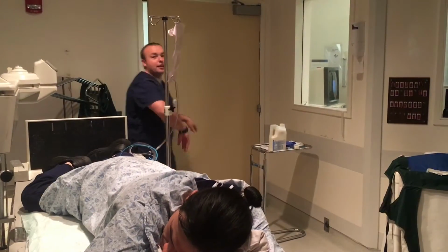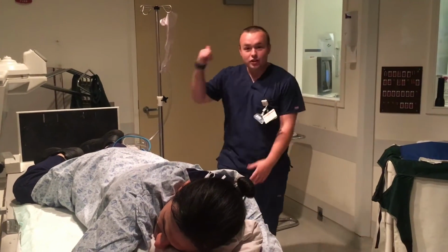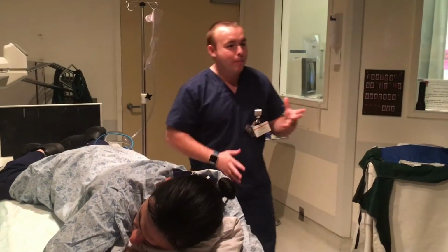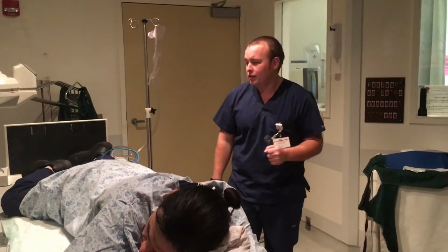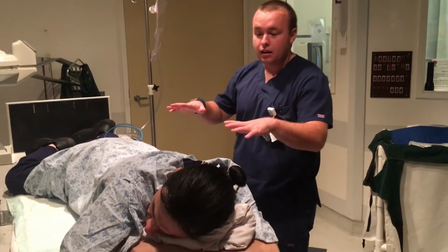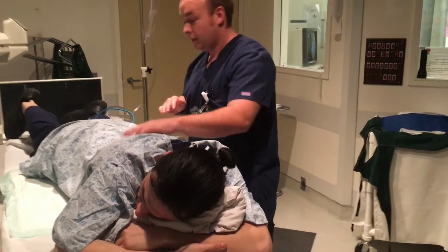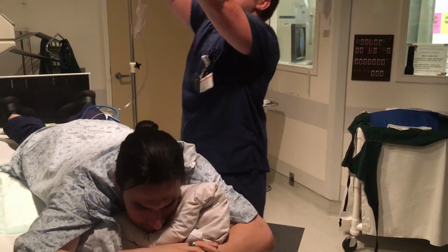Alright, so the doctor just left. He just finished his fluoro. I'm going to do my overhead pictures. We got about 7 or 8 pictures to do. I'm going to start off with the PA. Patient's going to be totally prone, so go ahead and straighten out this leg. Yeah, just nice and flat.